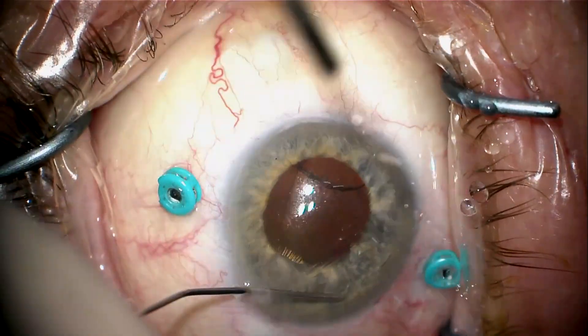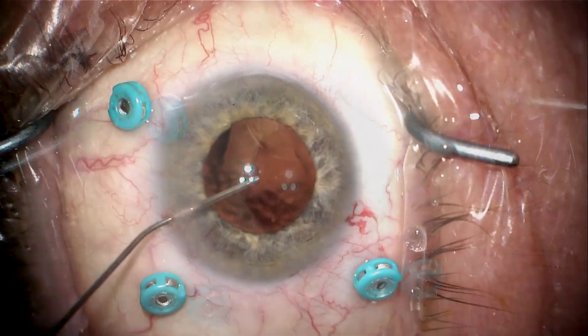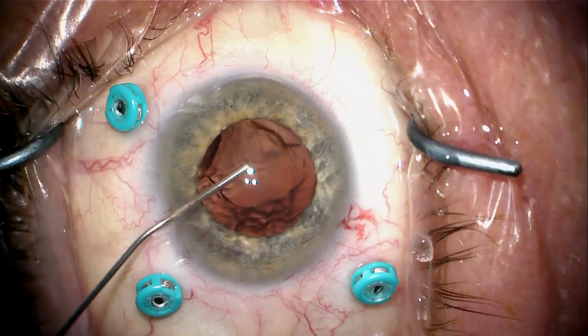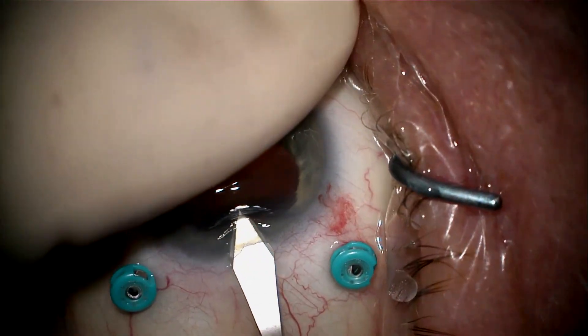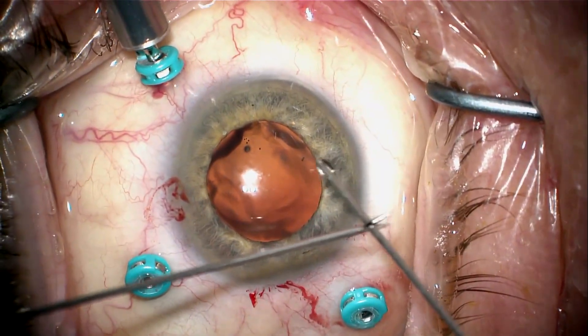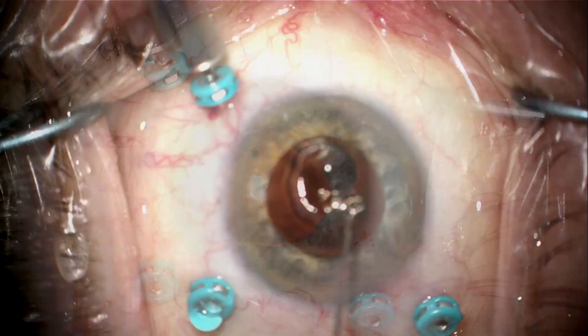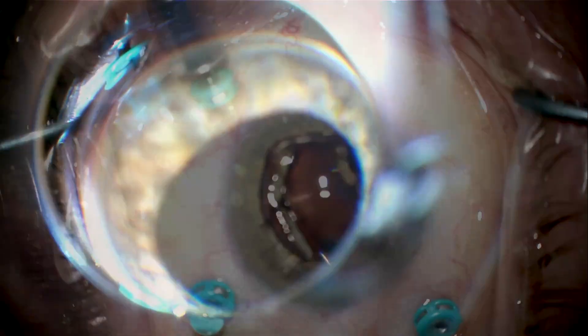I'm placing dispersive viscoelastic into the recess of the angle to keep the pupil dilated and protect the cornea. I then switched to cohesive viscoelastic to push that dispersive viscoelastic against the cornea. Now I'm going to modify my maxi-grip forceps so the jaws will open wide enough to grab the lens when I need to.